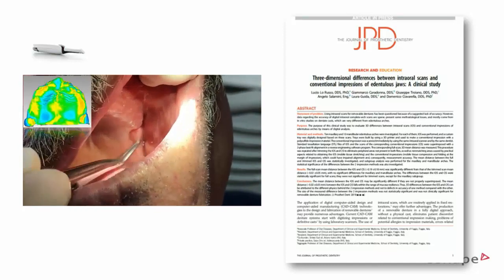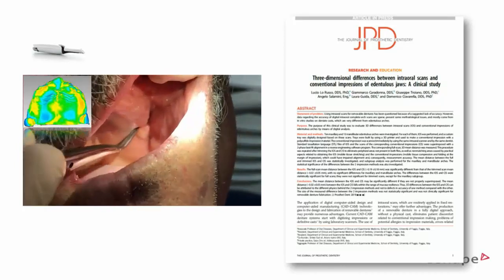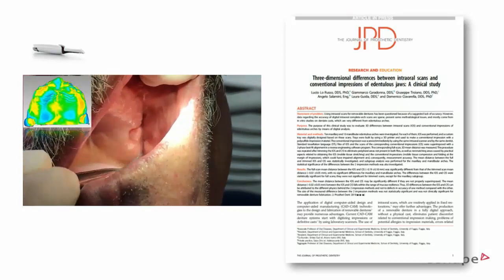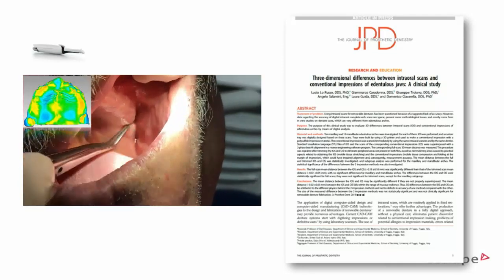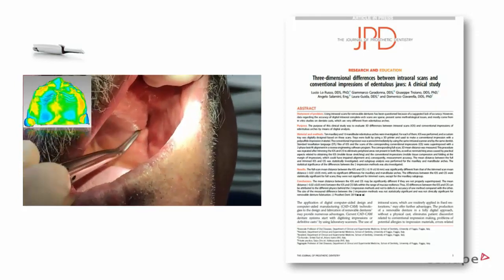We are working on a scan strategy along with him, and we will soon publish that. So you will soon get to know what scan strategies he's going to use. There are also questions about how you take the bite registration using the TRIOS and the intraoral scanners. I think soon we'll come up with much more information which will make it easier for you to understand.